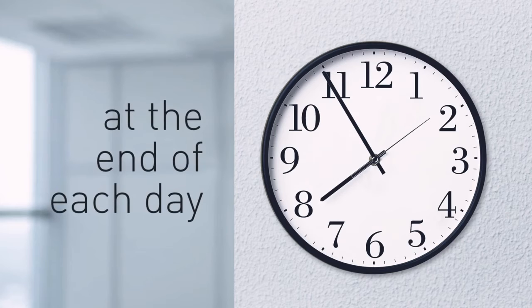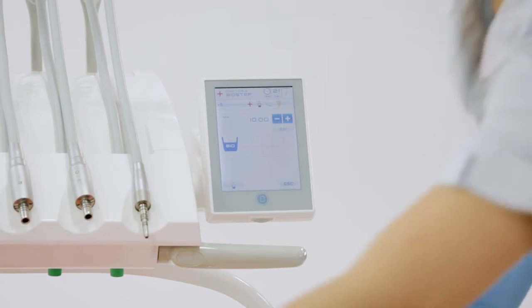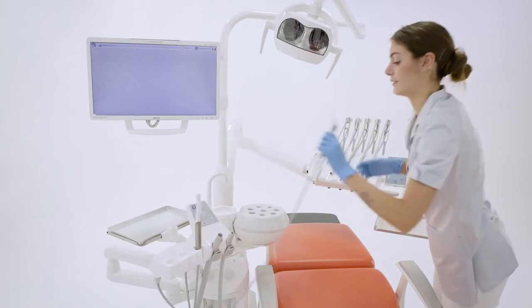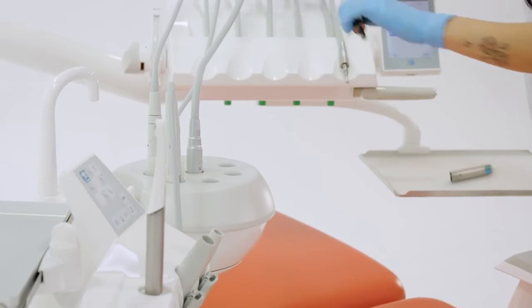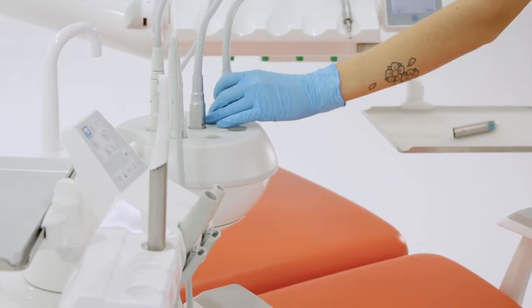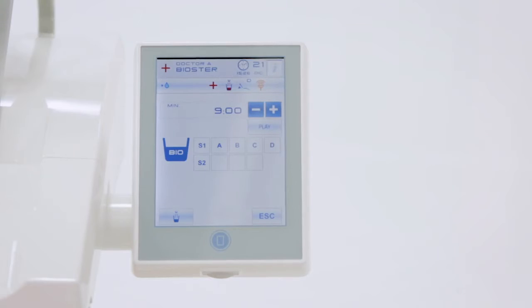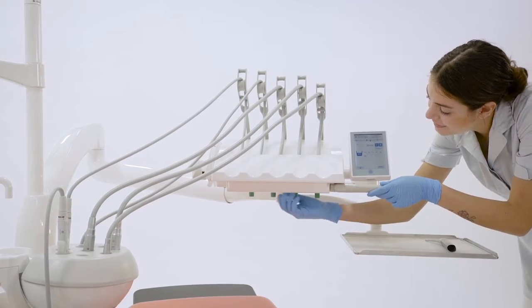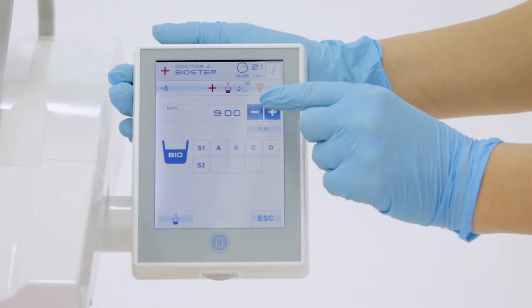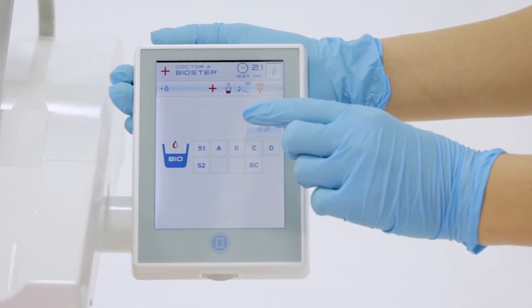Other operations are recommended at the end of a work day. From the full-touch control panel, the assistant prepares to run the Bioster cycle before removing the instruments. The instrument hoses are placed in the specially provided tub, and the assistant ensures that the nozzles are fully open. A personalized running time can be set, and the assistant then presses play to start the cycle.